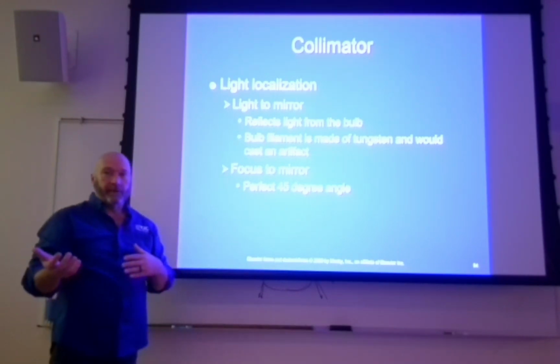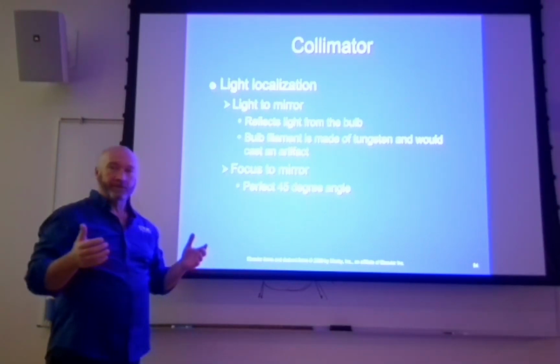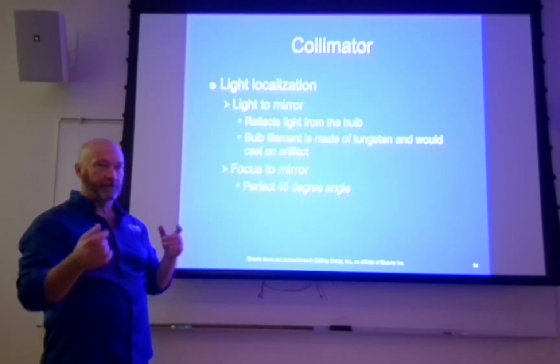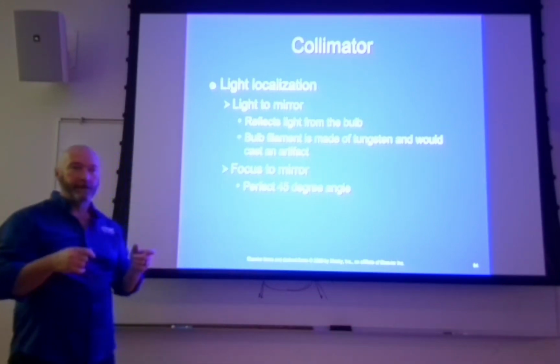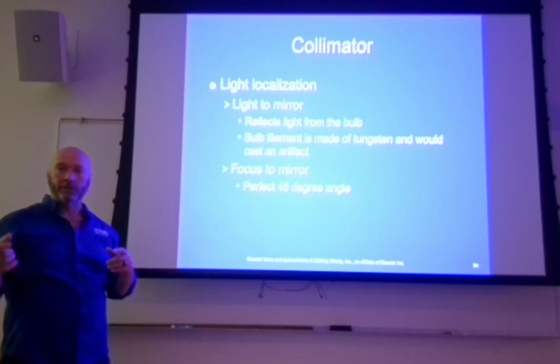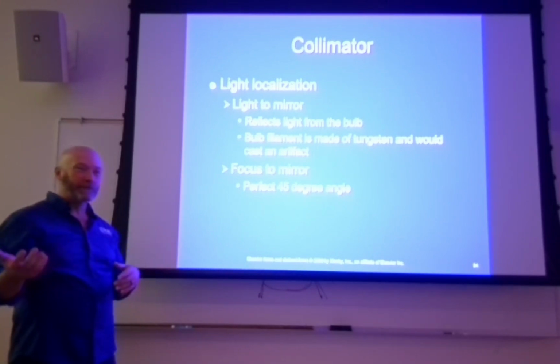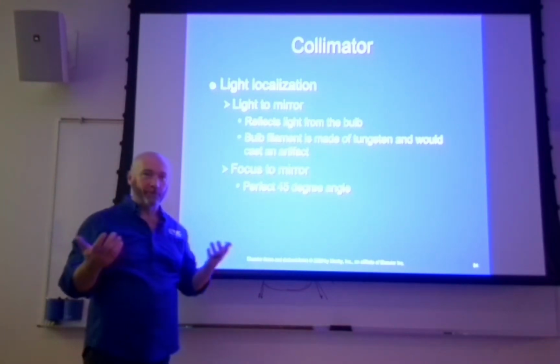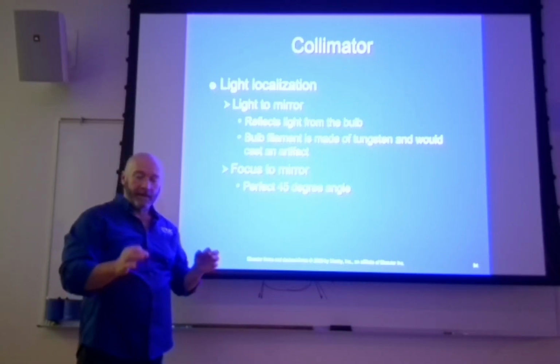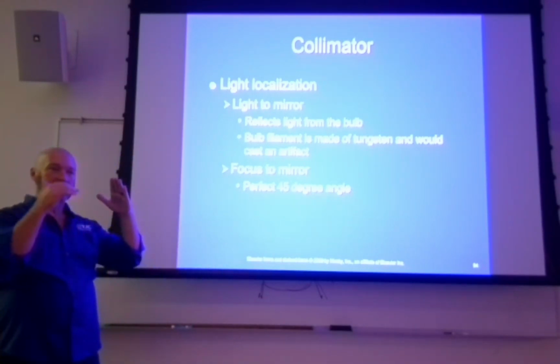So your collimators can be off by like 0.8 inches if you're shooting at 40 inches, okay? That's about the size of a penny. So when you go into clinicals, if you have some pennies on you, you can measure the accuracy of your collimators. I think a penny is actually 3/4 of an inch. So, 3/4 of an inch is 0.75. So 40 inches, 0.8 inches. That's the same.